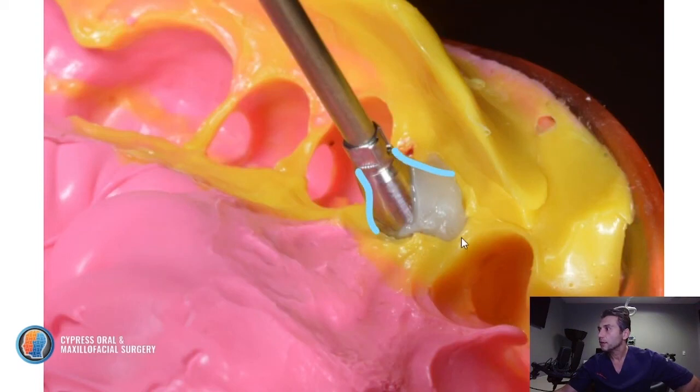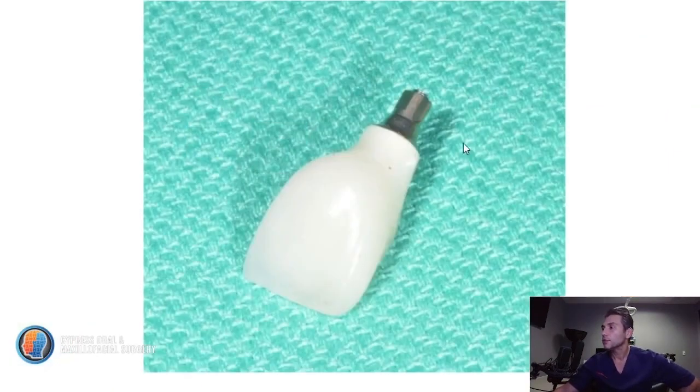So they're going to make the crown under the soft tissue, because this is the implant platform right here. The implant platform is right there. So they're going to make a crown that looks exactly like the temporary you made. And I hope this helps. Here's an example of when we did this. This is a final restoration. It's a screw retained restoration. This is not this case, but it's another patient, but notice how smooth and nicely transitioned the contours of the crown are. This gives perfect results.